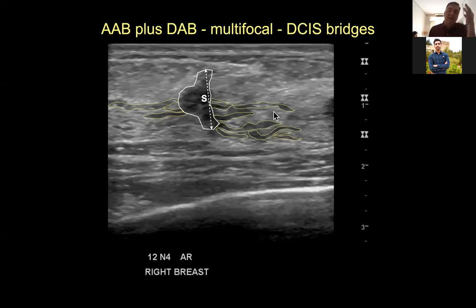I'd be less aggressive. When the ducts are 4 times normal, I'm going to be aggressive with the vacuum biopsy. When they're two times normal sized ducts, I'm going to be less aggressive, and I may sit back and wait for MR or just see whether or not the margins are positive or not.